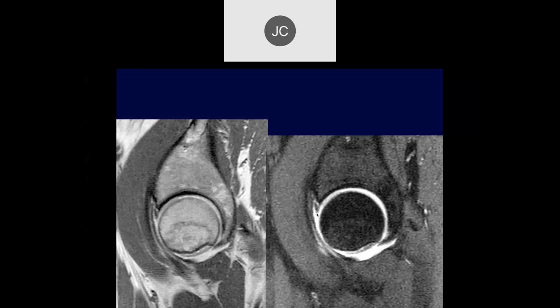Robert, looking at the hip, the anterior labrum looks like there's some irregularity and tearing at the base of the anterior labrum — right in through there. This was a confirmed labral tear. Chondrolabral junction congenital defects or sulci rarely occur in the anterior labrum, so if you see fluid extending deep to the anterior labrum and the bone, it's most likely going to represent a tear.